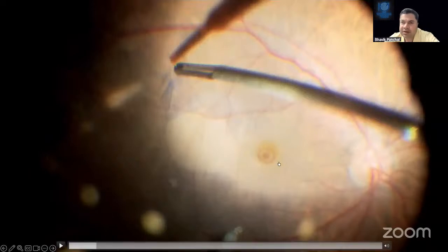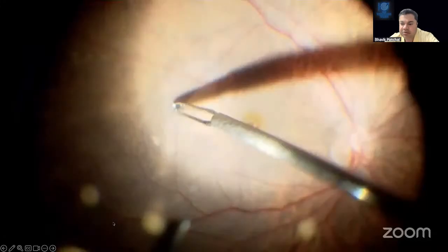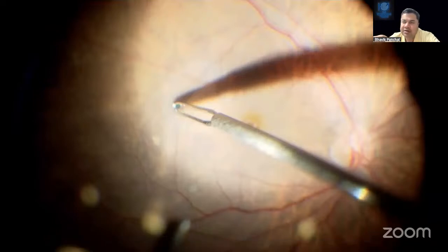Sorry, this was earlier covered, but I just want to bring it up since I saw the BBG dye being injected as well. One has to be careful about a jet stream injury. So always inject outside. And I would suggest that rather than directing at the fovea, even in Abhishek's case or Parth's case, we noticed that one can also direct the dye on the light pipe or in the superior or inferior part of the nasal retina. That will prevent a kind of jet stream injury.